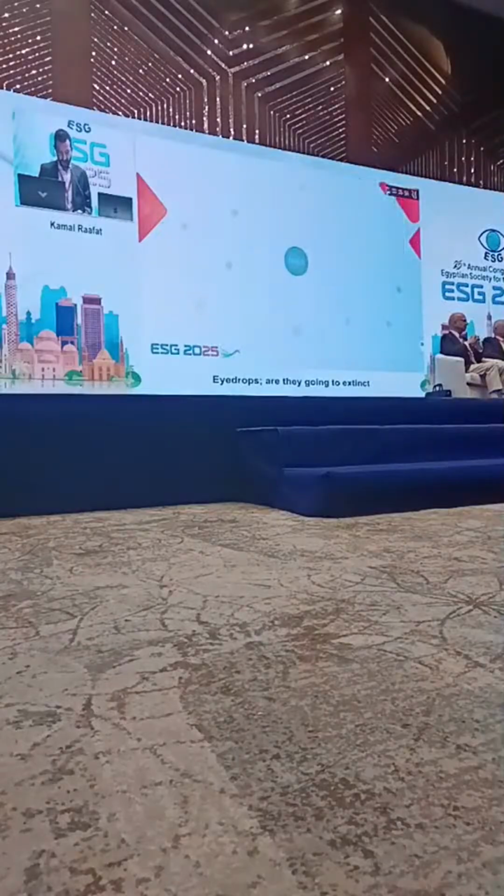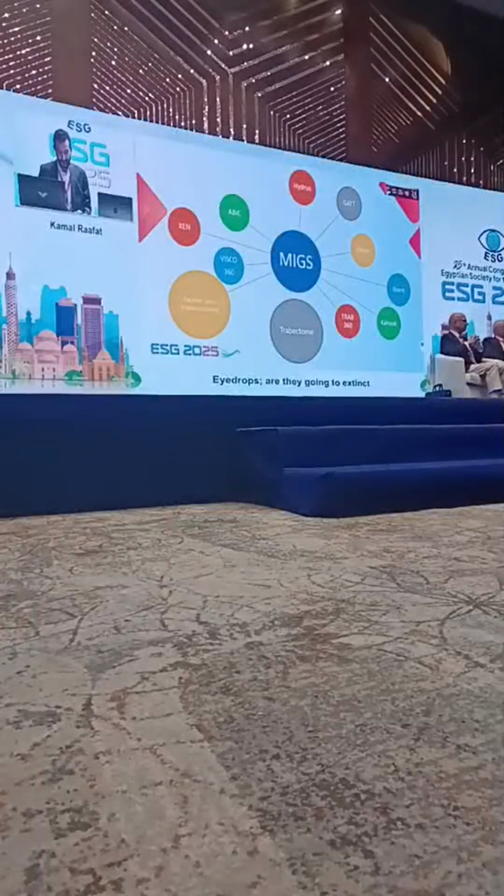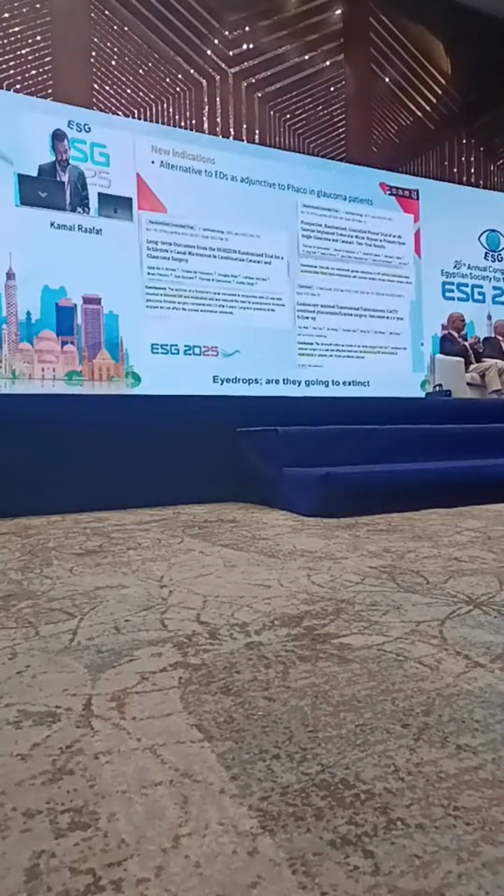But based on their high safety profile, since the introduction of MIGS, there is a growing and powerful change of concepts that defies the classic concept of using eye drops as the first line of treatment in milder forms of glaucoma. Now we offer MIGS unconditionally in all stages of glaucoma in combination with cataract surgery as a replacement of eye drops.